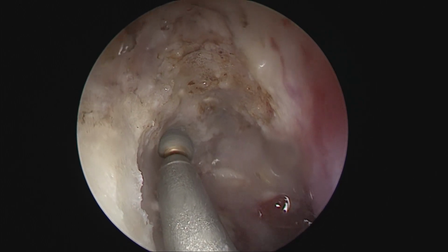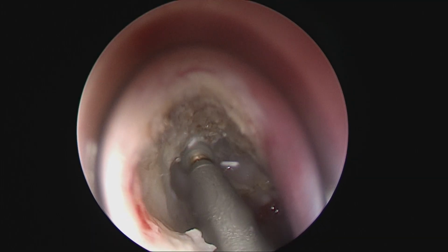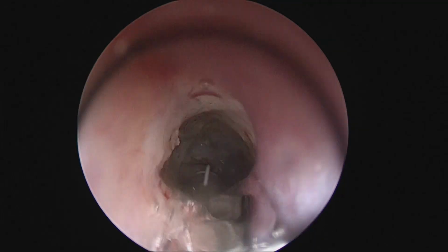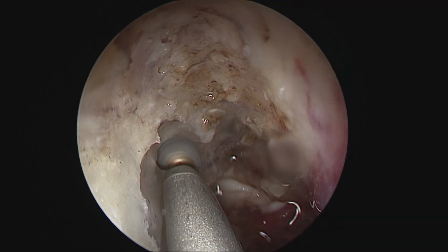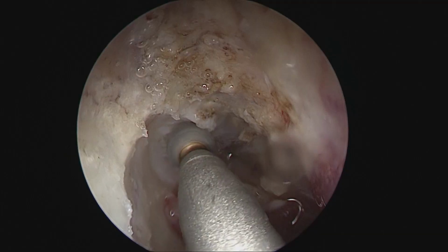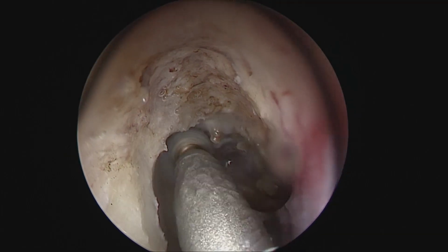So you see, we are constantly trying to navigate or locate the frontal sinus, and that is not easy given the fact that this is a hypoplastic or a very small frontal sinus. It's not a widely pneumatized one, and if it is indeed filled by the tumor, you possibly will not be able to enter inside the frontal sinus, as compared to when it is just full of secretions or mucopus.